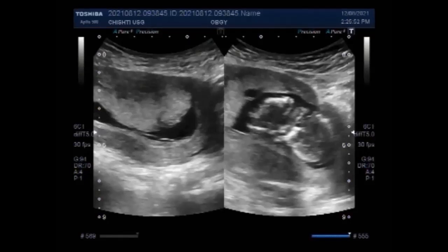Missed miscarriage means that the baby has stopped growing, as you can see in this case, or there is fetal demise, but there are no miscarriage symptoms such as bleeding or pain. It can also be called delayed miscarriage. Some women do not experience any symptoms of miscarriage at all. However, possible miscarriage signs besides bleeding include mild to severe cramps, pain in the back or abdomen, loss of pregnancy symptoms such as nausea or vomiting, white pink mucus discharge, passing tissue or clot-like material.